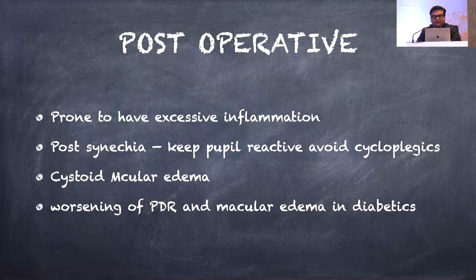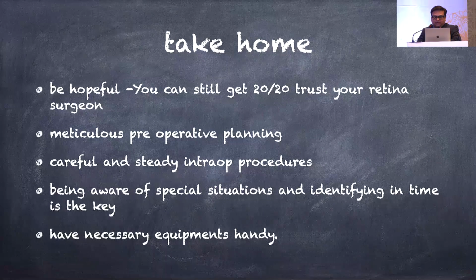And macular edema can worsen in all of these cases. So be watchful, do an OCT, and give an anti-VEGF as and when required. So, take-home messages: you can always achieve very good results despite the patient having undergone a retinal surgery.